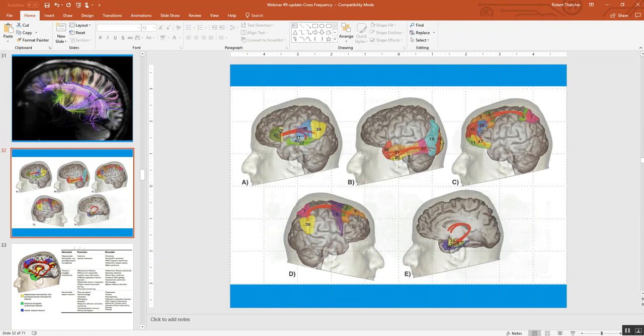But it's important to note that there are now atlases of the diffusion tensor imaging, this one by Dell'Acqua and Catani. And these are Brodmann areas, like for example, Brodmann 39 and Brodmann 45. This is frontal parietal, very, very important in intelligence, but they're able to show that these subgroups exist. And what's important is EEG has sufficient resolution to be able to look at centroid voxels, for example, of Brodmann 39 and Brodmann 45, and see how they're cross-frequency coupled, or coupled within a band.